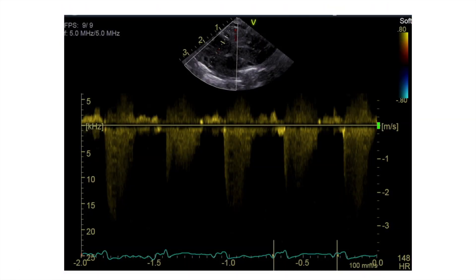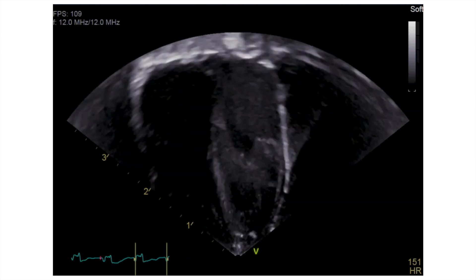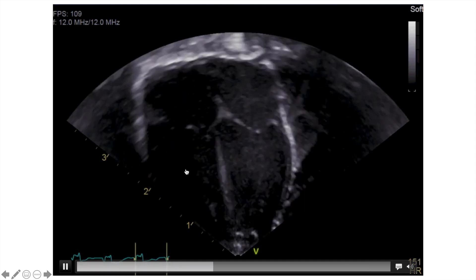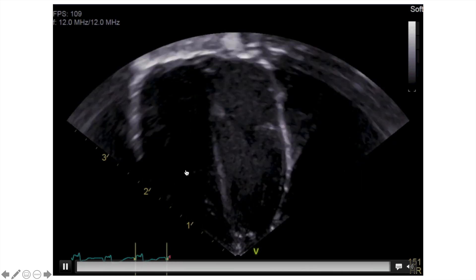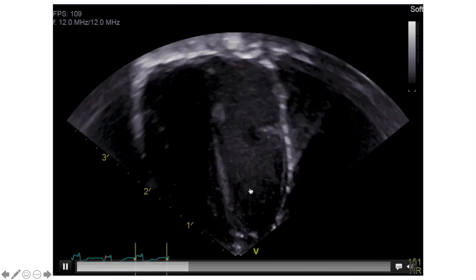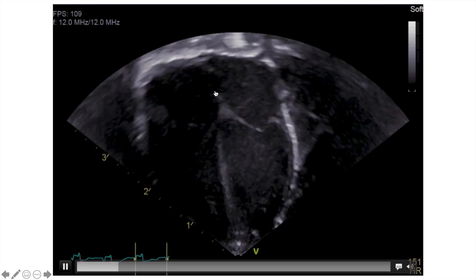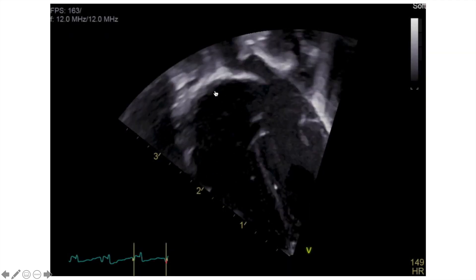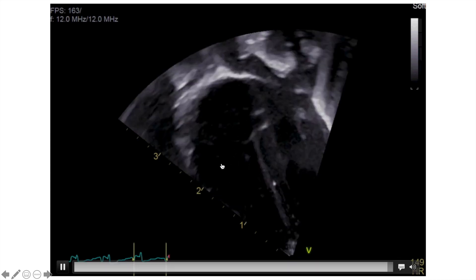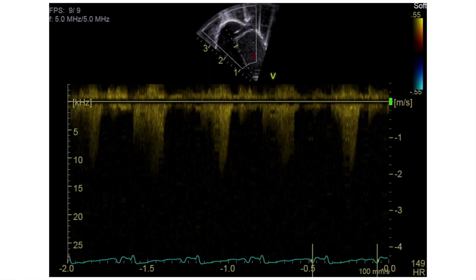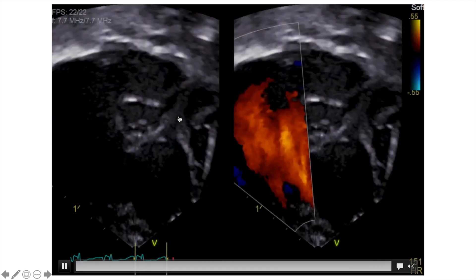Also from the apical four-chamber view: the right atrium is on top and the right ventricle is close to the probe on the right side of the heart; the left atrium is on top and the left ventricle close to the probe on the left side. The interventricular and interatrial septa are also visible. We use a modified right ventricular view focusing only on the right side of the heart, and we Doppler it to check the TR jet.